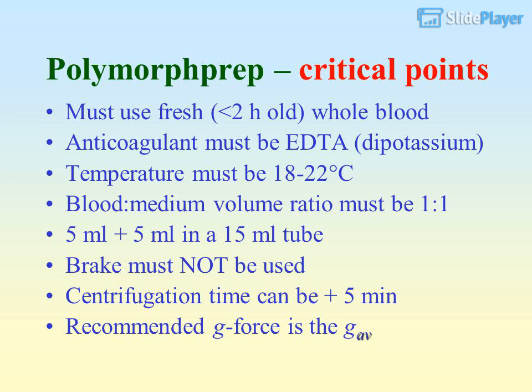Note, even though the original paper describing this method recommended heparin as an anticoagulant, our own experience shows that EDTA provides more reliable results. Unlike the protocol for Lymphoprep, which recommends the use of diluted blood, this method will only work with whole blood, and nothing else. For explanation of GAV, see next slide.